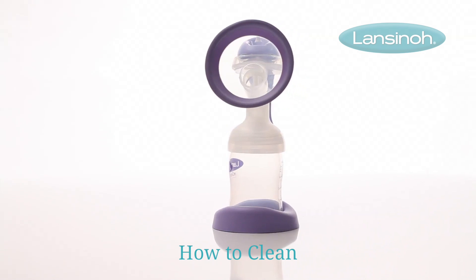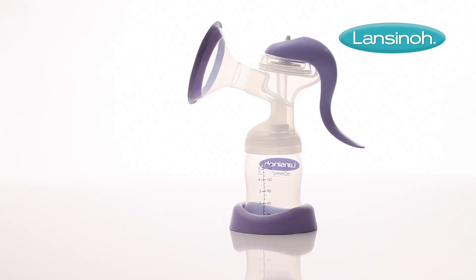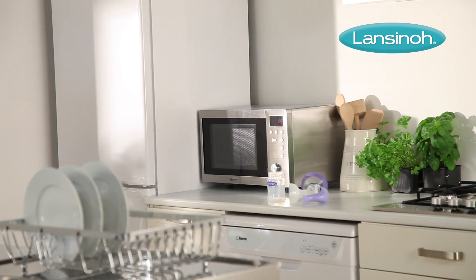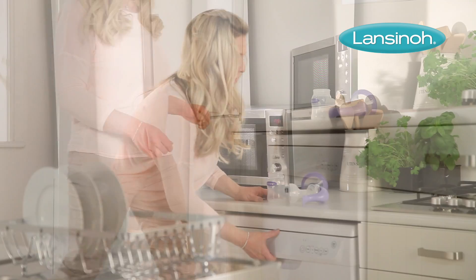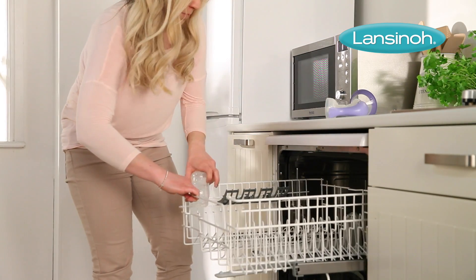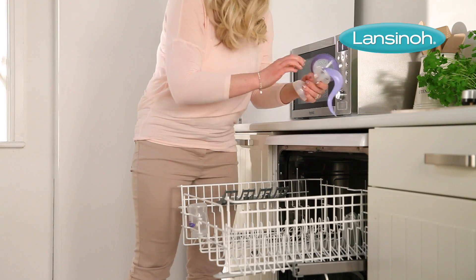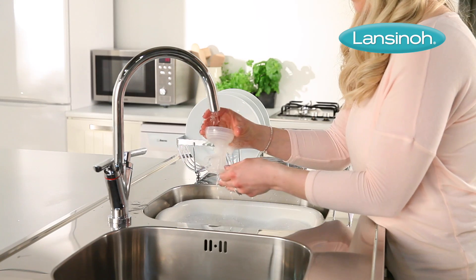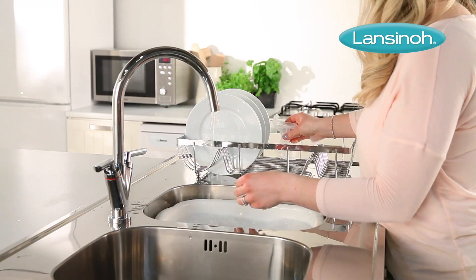Before you use your Lanceno Manual Breast Pump for the first time, take it apart and clean it thoroughly. The breast cushion, bottles, handle and stand can be cleaned in the upper compartment of your dishwasher or hand washed with mild soap and hot water. Do not use solvents or abrasives, and remember to rinse with hot, clean water after cleaning.